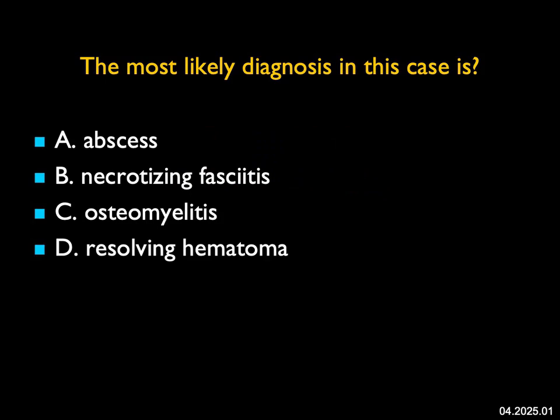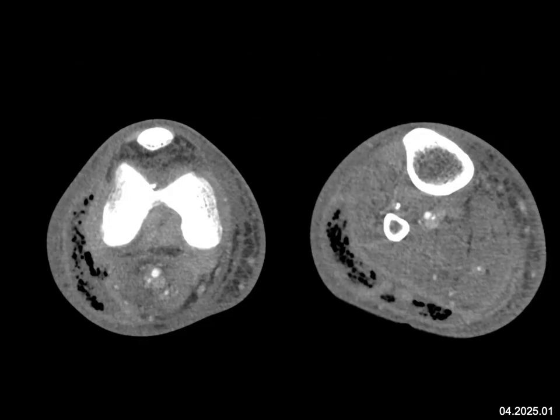The most likely diagnosis in this case — we have images at the level of the knee and then beneath the knee in the mid-calf. You can see laterally along the fascia, there's air tracking along the fascial planes. You can get air from intramuscular injection or trauma, but when you see air, you've got to be thinking about infection. When it tracks along the fascial planes like that with soft tissue swelling, you can consider an abscess, but the tracking is more than an abscess.